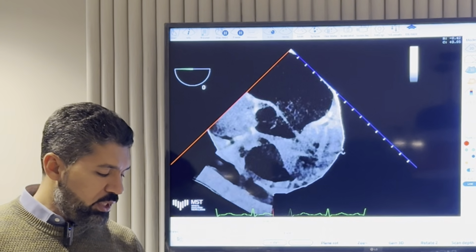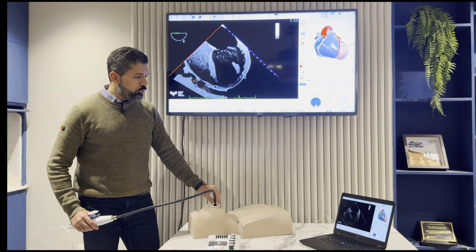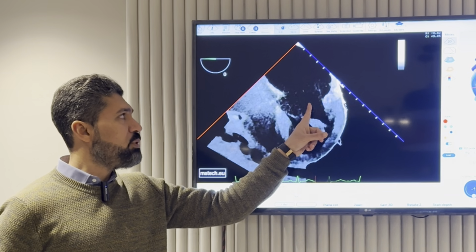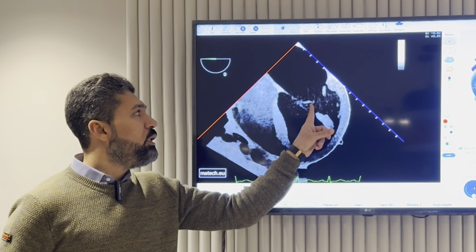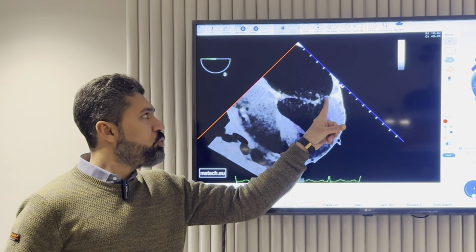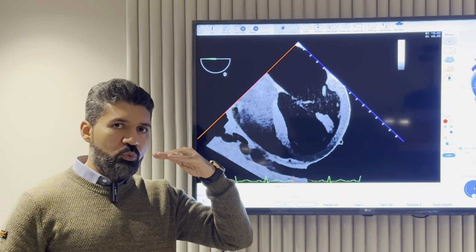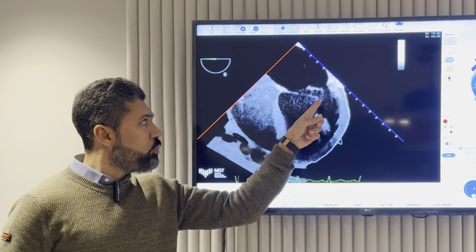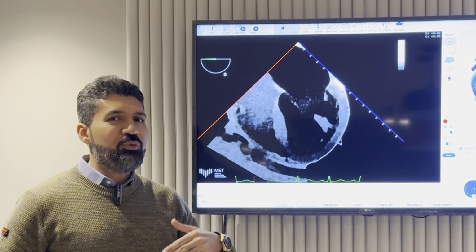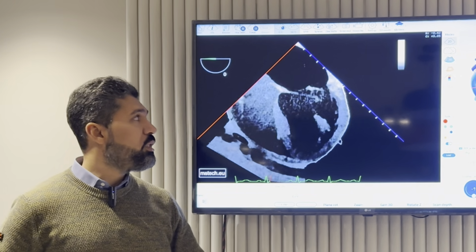What's the next step? Advance the probe a little bit down, like that, to have the 4-chamber view. Once you have a 4-chamber view, you don't see the aortic valve. That means the tips here are for A2 and P2. A2 here is intact, but P2 is flail, as you can see. So 5-chamber view, 1 on 1, 4-chamber view, 2 and 2. So till now, P2 is prolapsed. Do not advance more to get A3 and P3 because 90 degrees is the view for A3 and P3.